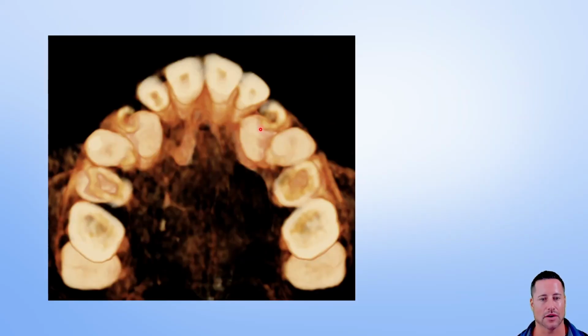If we look at an occlusal view, here's the patient's right and left, you can see just how palatal those teeth are. So again, this now tells us we definitely want to send the patient for removal of the primary cuspids, as well as prepare them for the fact that these teeth may end up being impacted. And whether or not we make the decision to do any exposure at this point would be a different conversation. But at the very least, you have increased diagnostic information that you can pass along to and share with the patient and their family.